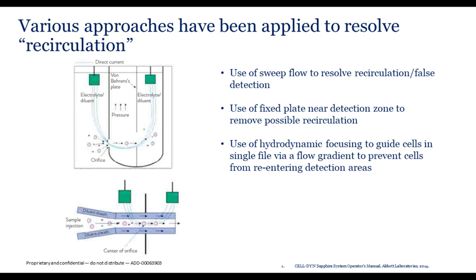Various approaches have been applied to resolve the recirculation artifact. Some manufacturers use lateral flow of reagents to sweep already-counted cells away from the detection zone. Others use a plate close to the orifice — called the von Behrens plate — to remove recirculating cells from the detection zone. Another alternative uses hydrodynamic focusing: a sheath of fast-moving fluid guides and confines the cell suspension through the orifice of the aperture, continuously propelling cells forward and away from the impedance detection zone, while also focusing cells on the very center of the orifice.